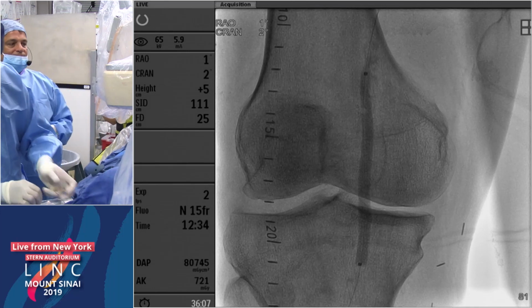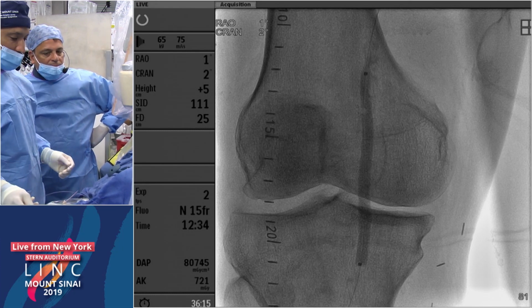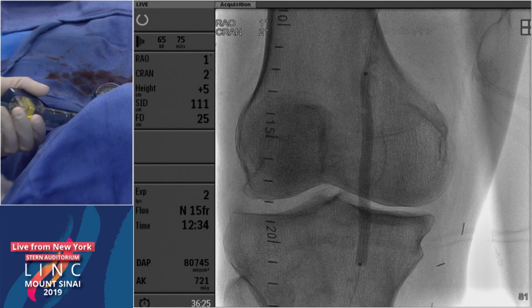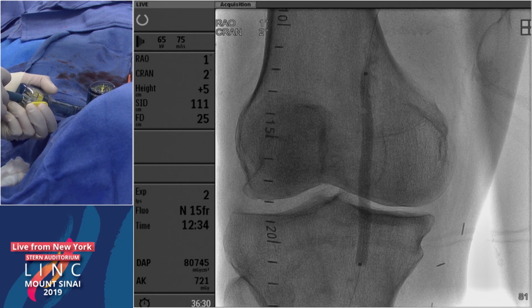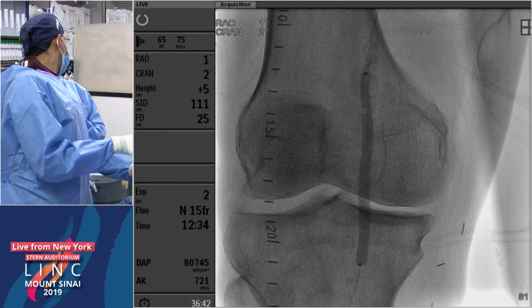Yeah, I mean, you and I obviously have had this discussion. I tend to just use balloon tamponade for these and try to avoid using a covered stent. I know you've had experience with some delayed ruptures of those, or delayed pseudoaneurysms, I think. I haven't seen that personally, but your comments on that have made me more inclined to use covered stents, for the reason that the mechanism of perforation with excisional atherectomy is you're actually shaving part of the wall of the artery there, and so you actually have a real tissue defect. So I've sort of leaned more toward using covered stents, but I still don't. In the few perforations I've had since we've had these discussions, I still don't use covered stents routinely.